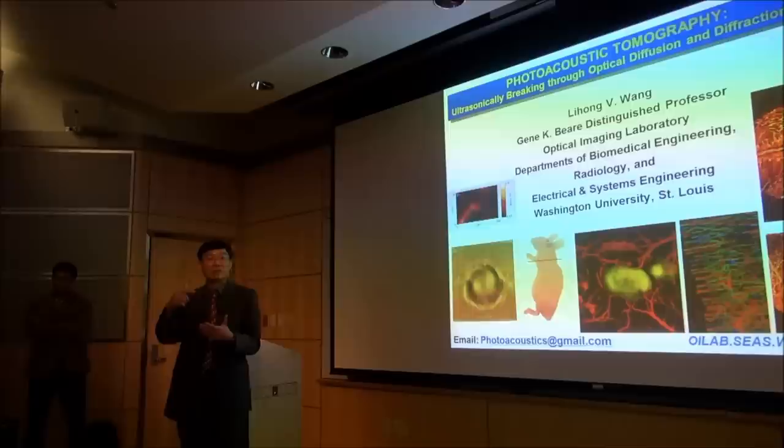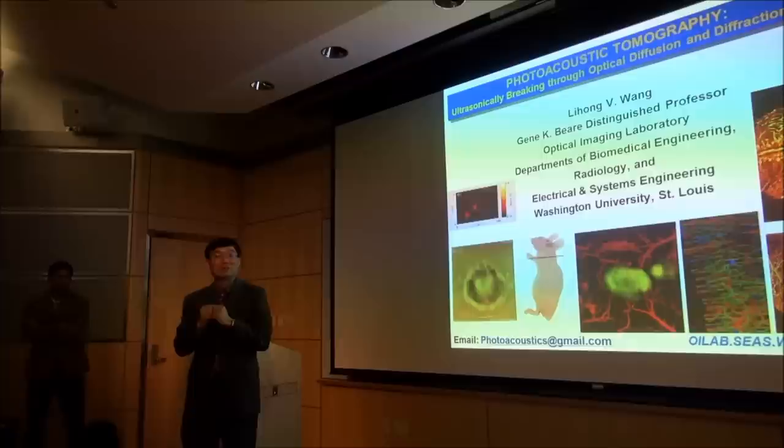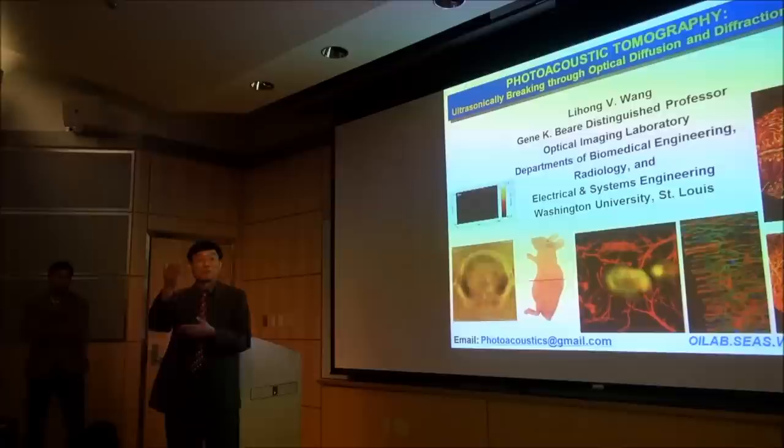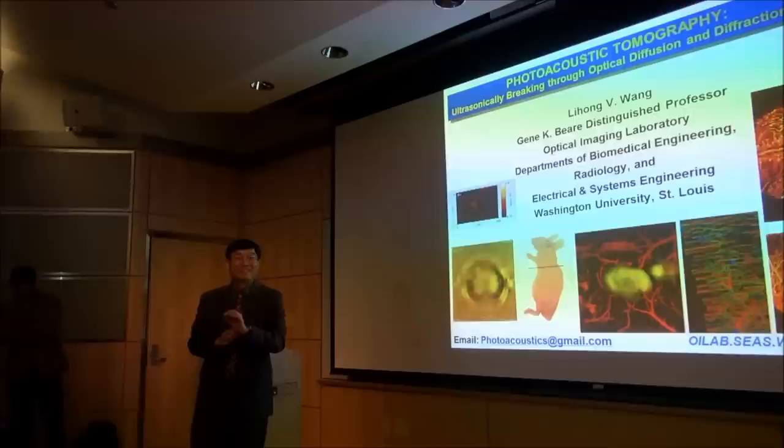One nice thing about this technology is that your photoacoustic wave measures how much heat, how much temperature rise, you're generating. So you can really monitor what's going on at any given depth. You can start from a low pulse energy, monitor it, and estimate how much temperature rise you're generating. Then you can go higher as long as you know that at the new level you're not generating any damage, because the damage at nanosecond laser pulse width is thermally based. So it's a fantastic tool to directly monitor how much energy you're depositing. Thank you.